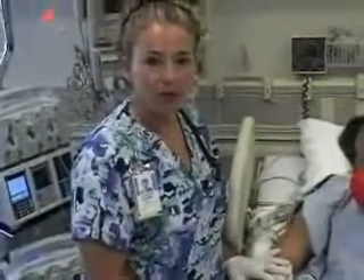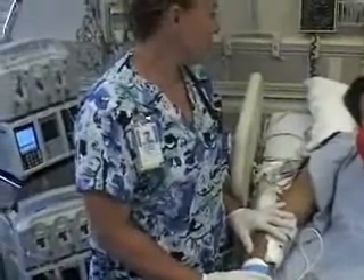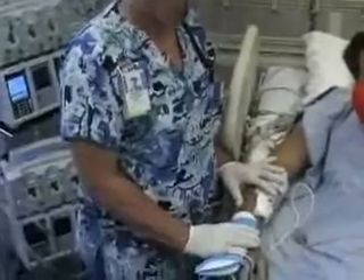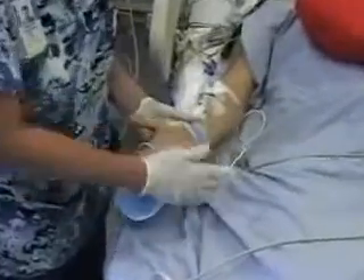Good morning, my name is Jennifer. We're here at Saddleback Hospital and this is Mike, our patient. We're going to be DC-ing his art line. This is the arterial line, and the port of entry is right here at the wrist.